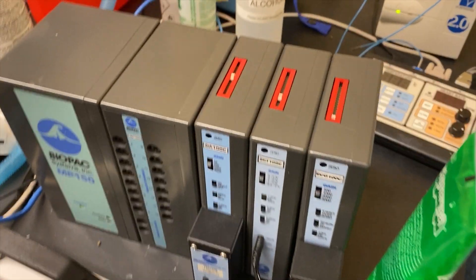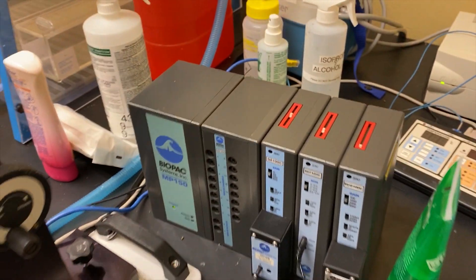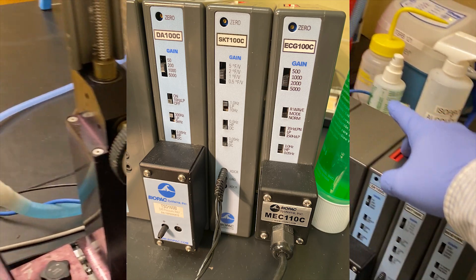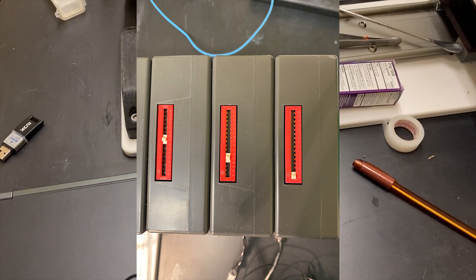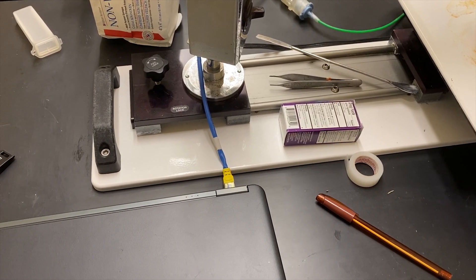After that I will take a picture of all the recording. This segment will be matched in the software. If this does not match you will get a wrong ECG picture.